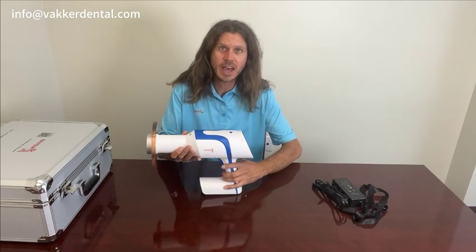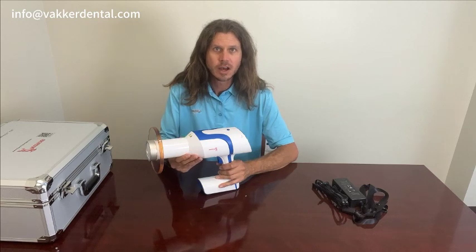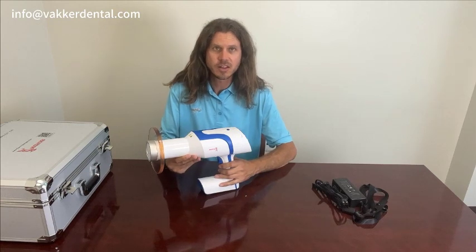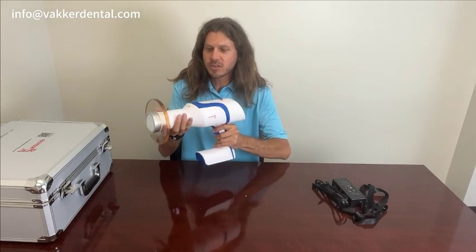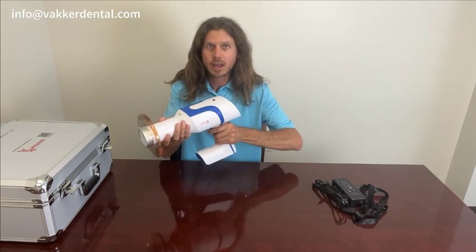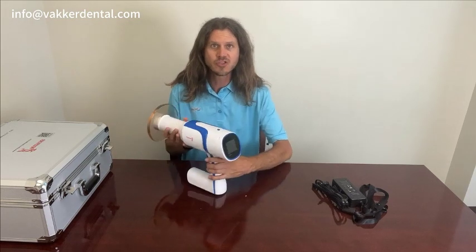It does come with 70 kVs and 3 milliamps, so it has more power than most portable x-ray units on the market, which is really nice. You're able to use less exposure to get the same type of shot, which is great. The unit weighs just about five and a half pounds. It has a long nose so you are able to get two hands on it to keep it nice and secure and get the right angle. With that, let's go ahead and dive into the touchscreen display.